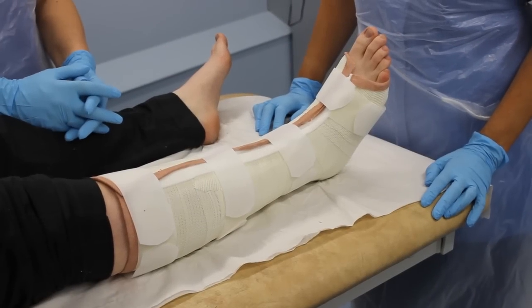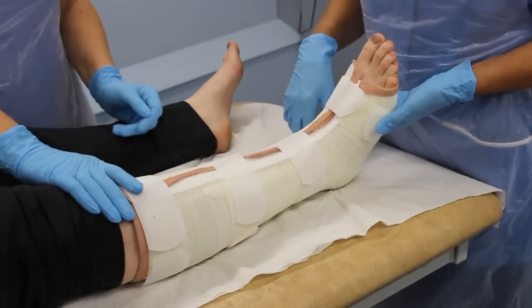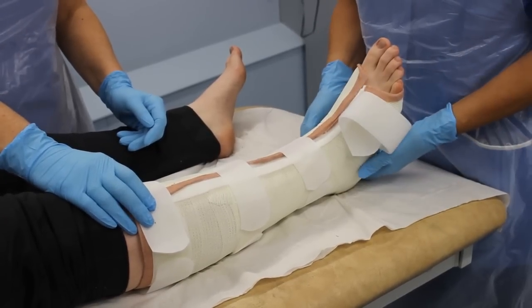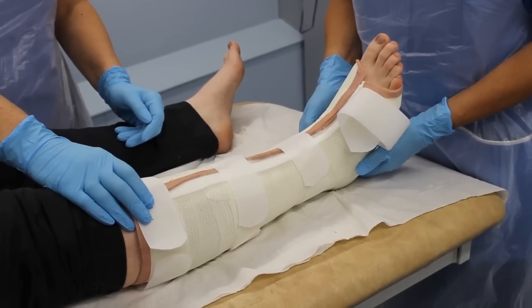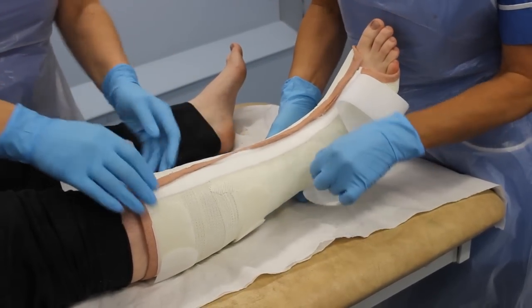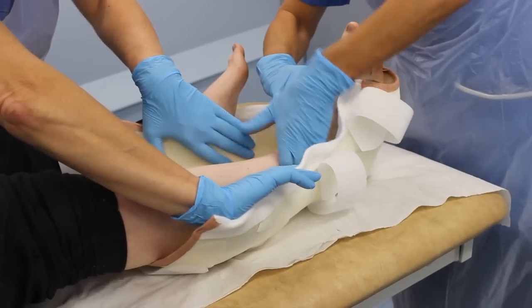Like all casts, this cast needs checking. If you have a removable cast, it may be held in place with Velcro straps or bandages. The doctor or nurse will inform you when the cast can be removed. To remove it, undo the straps or bandages, spread open the flexible section of the cast using your hands, and lift the limb free.